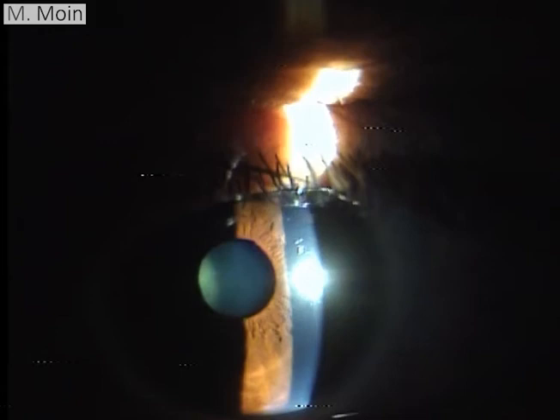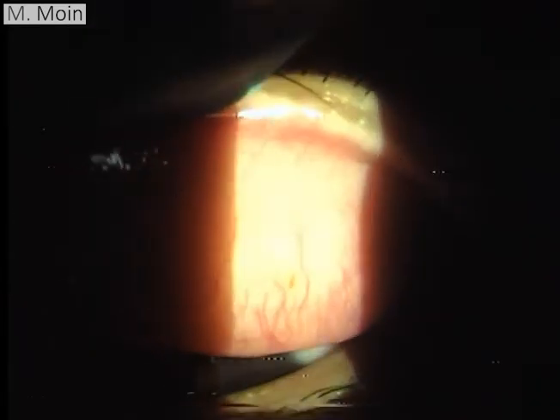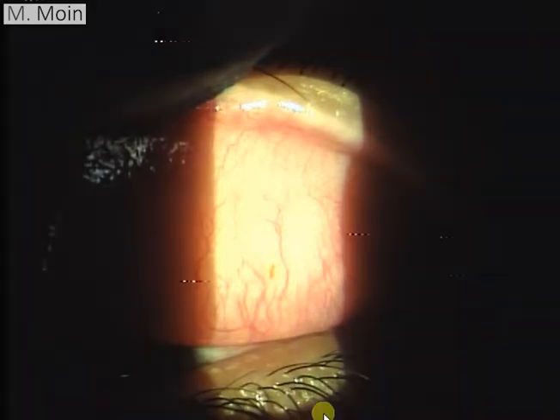Welcome to this video on slit-lamp examination, in which we are going to show you a patient who complains of redness of the eye after feeling something going in his eye. You can see some ciliary congestion or conjunctival congestion. After everting the lid, we find he was riding a bike and felt something go in the eye — and here you can see an important area to visualize.